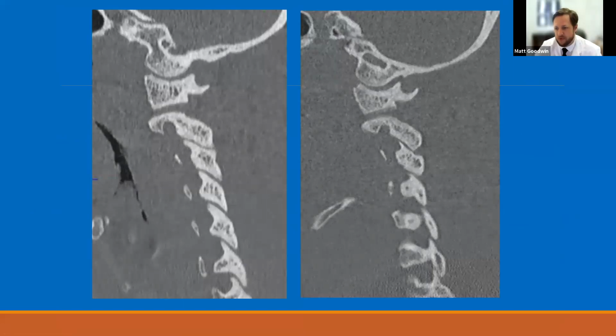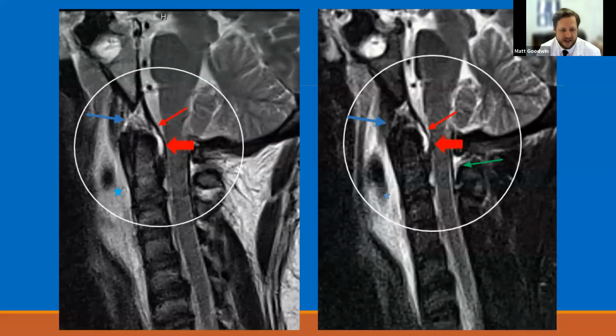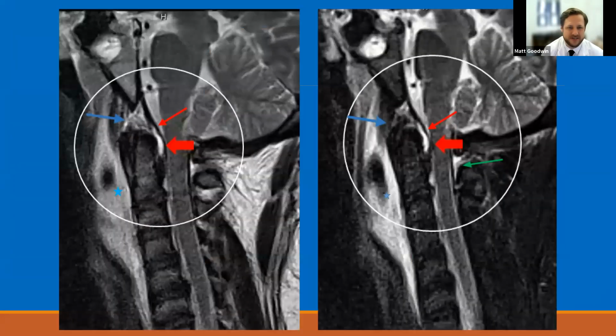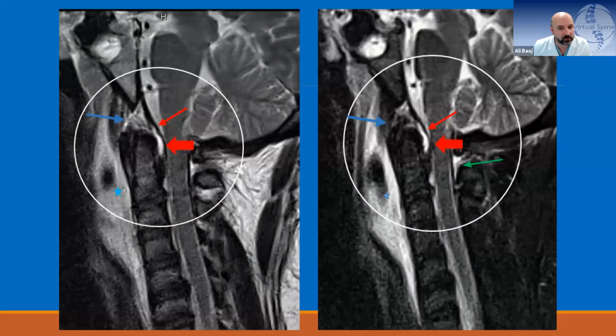Sorry, Matt Goodwin, WashU. I'm just curious, Ollie, for that case, because man, that's a great case. That CT is so underwhelming, and we see this, right? Then you get the MRI, and you go, what am I doing? Would you do an exam under anesthesia for this, or how do you treat these? Yeah, Matt, was that question for me? Yeah, I'm just curious.